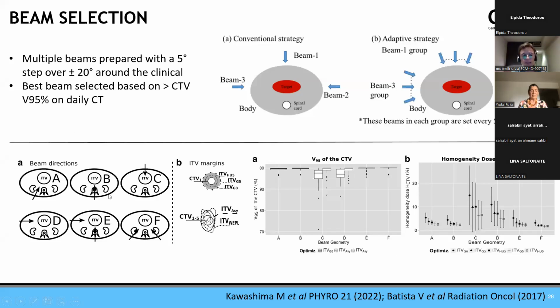While in Heidelberg, they have a gantry. Here, I think they obtained this orientation with the cradle, or by turning the patient. They studied which was the best beam direction, and they concluded something which could be obvious, but it was also concluded by the study before.